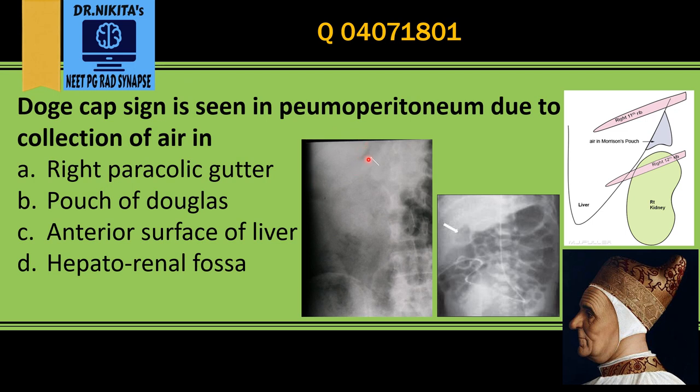If we have a look at the radiographs now — this is the liver, the white shadow, and below that we see this black collection of air between the liver and the kidney. So in Morrison's pouch, like the doge cap, we see this triangular or doge cap collection of air in the Morrison's pouch, that is the hepatorenal fossa. So the Doge Cap Sign in pneumoperitoneum is due to collection of air in the hepatorenal fossa or Morrison's pouch.